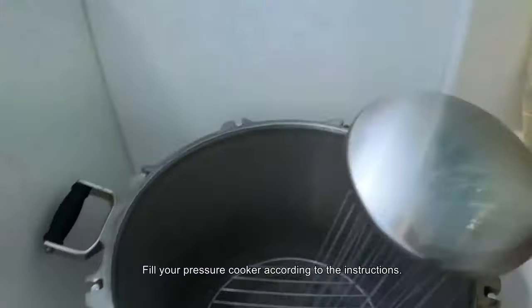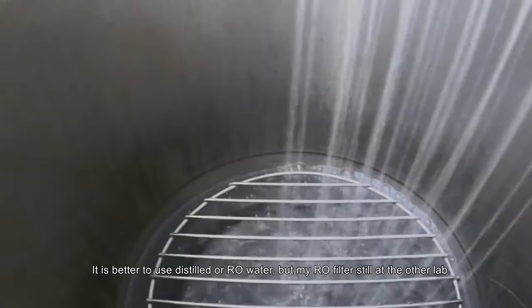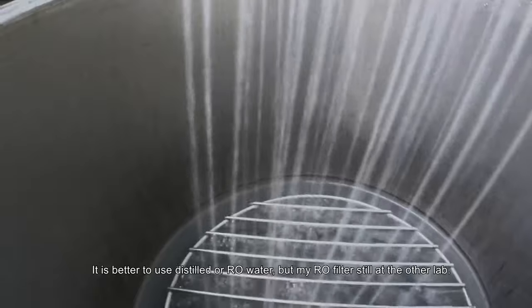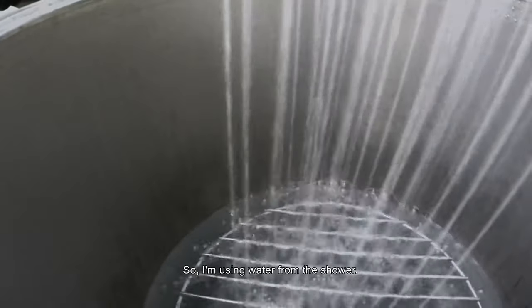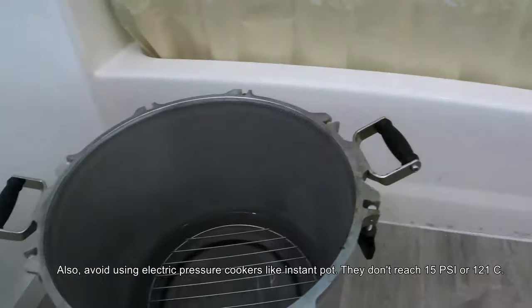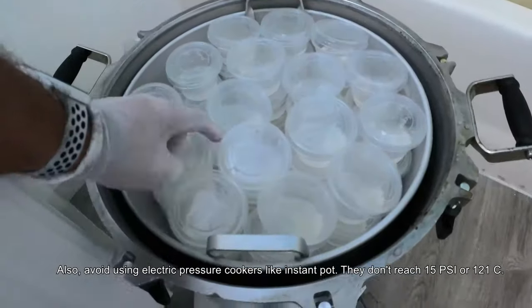Fill the pressure cooker according to the instructions — mine has a line to mark the amount of water needed. It's better to use sterile or RO water, but my RO filter is still at the other lab so I'm using water from the tap. Also avoid using electric pressure cookers like the Instant Pot — they don't reach 15 psi or 121°C.